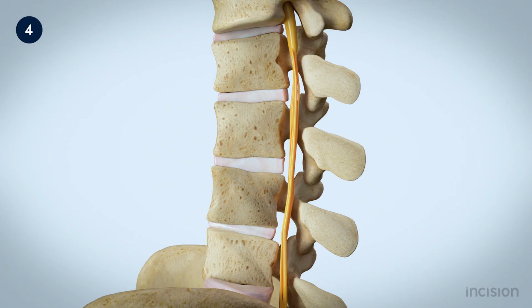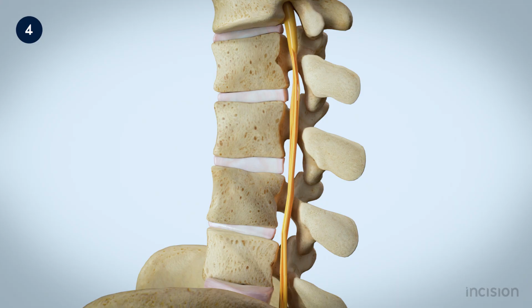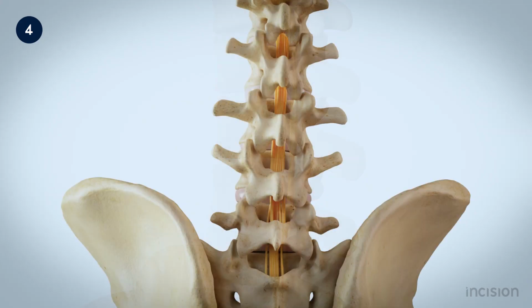Site preparation begins with identifying the correct level for injection of the spinal anesthetic. The spinal cord terminates at the conus medullaris at the level of the L1-L2 interspace. Inserting a needle at this level or higher carries a risk of causing spinal cord injury and should not be done. The L2-L3 interspinous space, the L3-L4 interspinous space, and the L4-L5 interspinous space are considered safe for the administration of spinal anesthesia. Identification of these spaces using anatomical landmarks will now be demonstrated with the aid of an inlay.